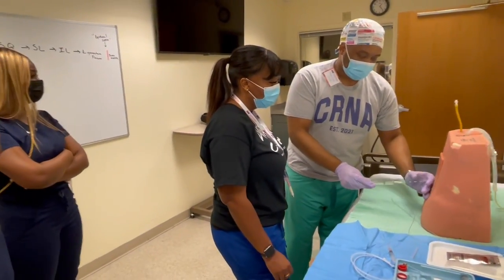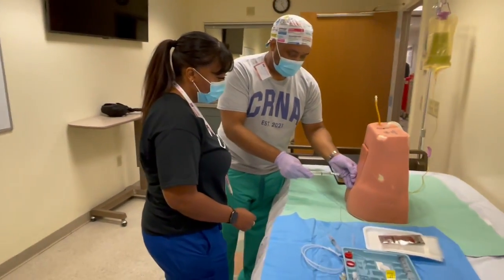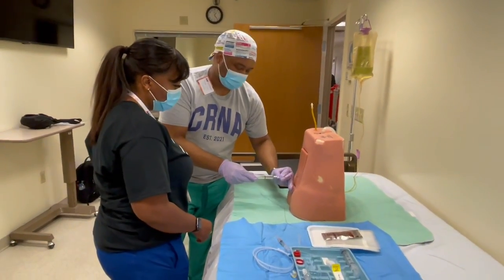Like I said, hand placement is essential. I like to kind of hold here, insert. You can hold here on the needle or on the flange — I'll come down and hold the flange.